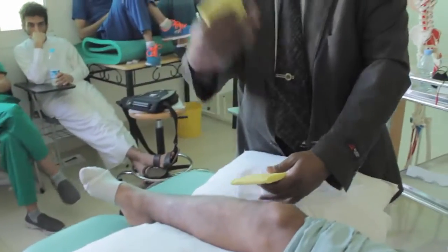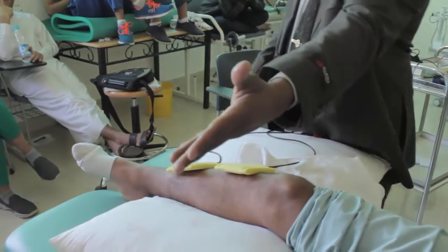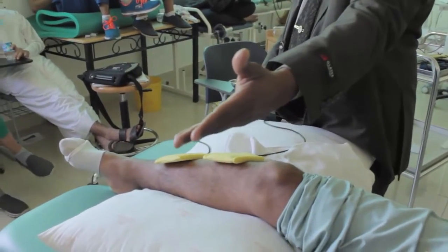That time you have to take 4 electrodes, like dorsiflexors of this side, dorsiflexors of other side, by 2 electrodes on this dorsiflexors and 2 electrodes on the opposite leg dorsiflexors.